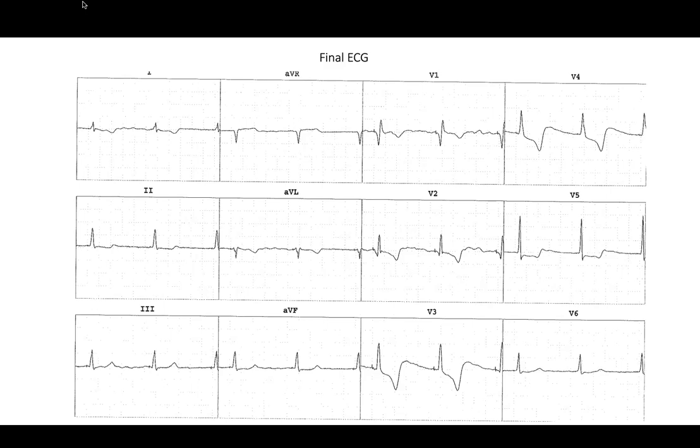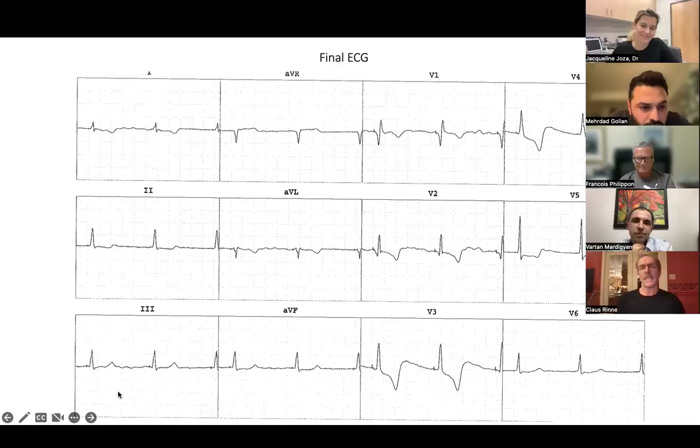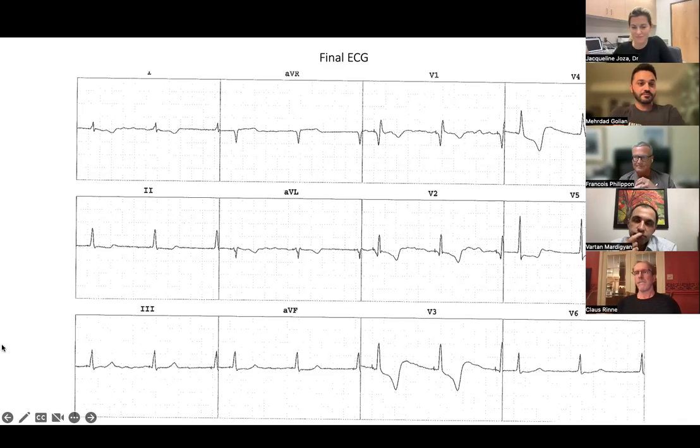So it's just a nice one, just for fun. It's amazing you can find the HIS. On a normal patient, we have a hard time finding the HIS sometimes. Well, yeah, as I say, if I have a hard case and I haven't found the HIS at the beginning, I've tried a bunch of spots, I often go back to the HIS, and if you get the exact spot, you just go 1.5 centimeters distal and all of a sudden, boom, you're there. Or, to be frank, sometimes I just pace the HIS every once in a while. I still do that, but okay, so that was then.